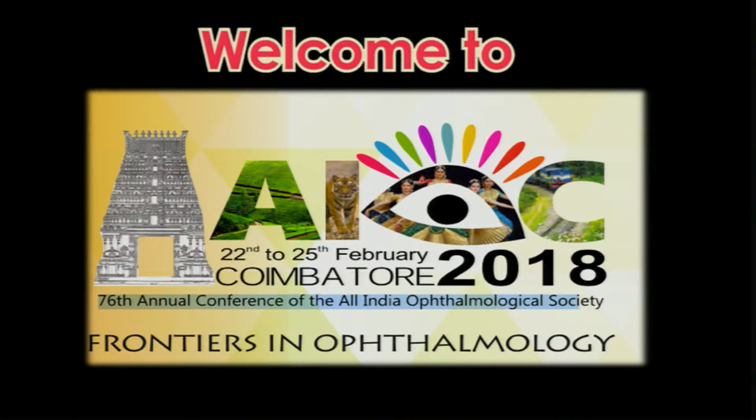Thank you. Dr. Anirudh has told us the advantages of ultra-wide field angiography, mainly for capillary non-perfusion in the extreme periphery, leakage, or if you want to detect some lesions like peripheral neovascularization or peripheral choroiditis or vasculitis. Any questions for Dr. Anirudh at this point of time? Well, yes. Can we have the floor mic, please?